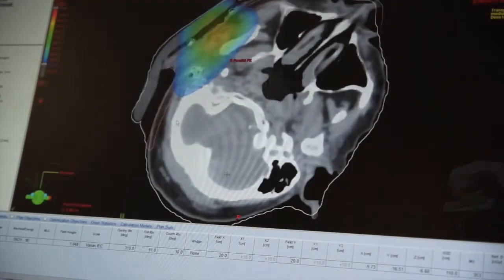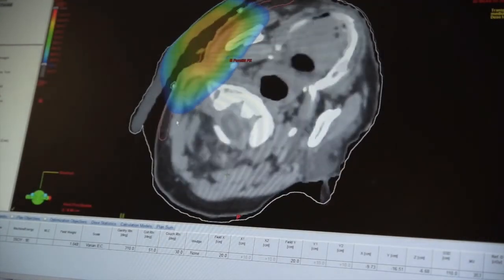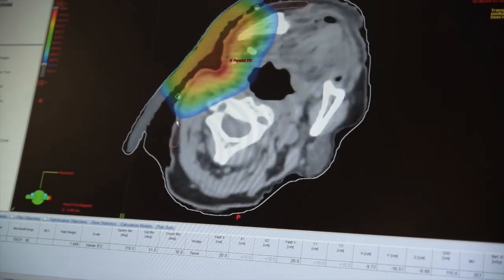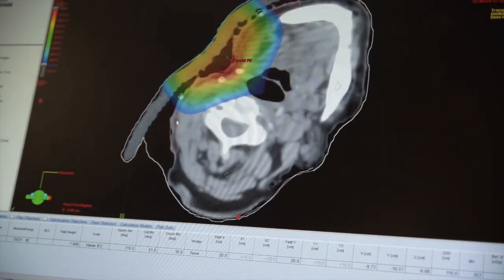This 3D modelling software is displaying dose on a patient's CT scan. It shows how electrons give a high dose to the skin, but don't penetrate far into underlying tissues.